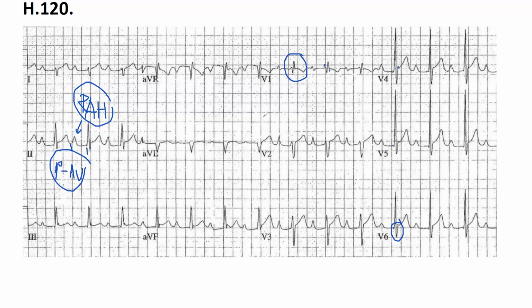So it's in the right bundle branch block. Yes. Okay.